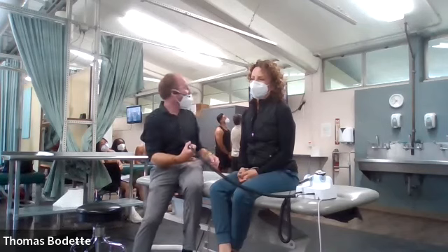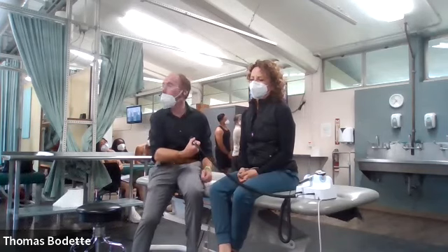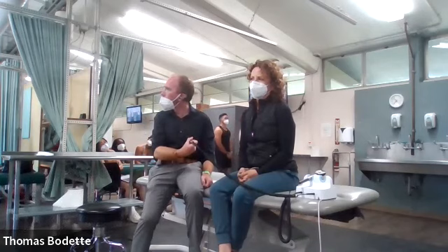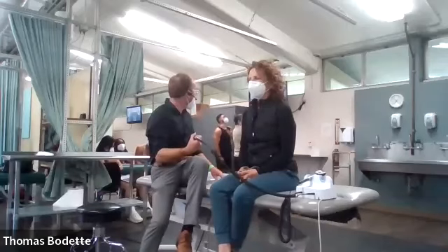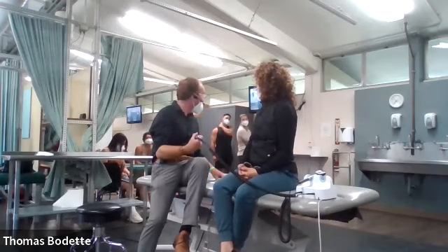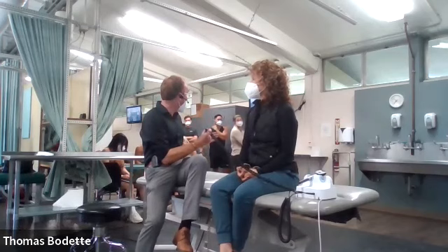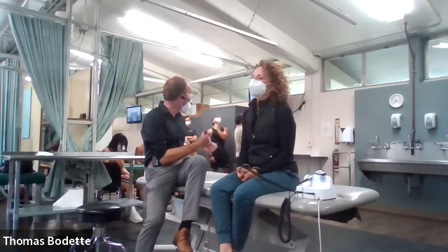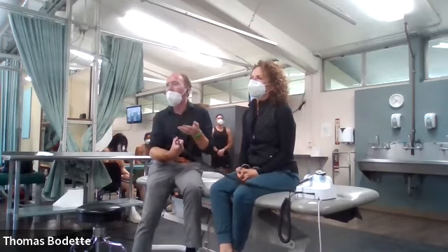What if the cone of light is not anterior, inferior? What if it's in a different place? What does that mean? Say what, Sean? Okay, so how do you explain that? So maybe the eardrum is bulging, so it's reflecting in a different spot.